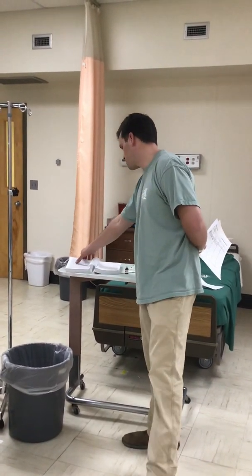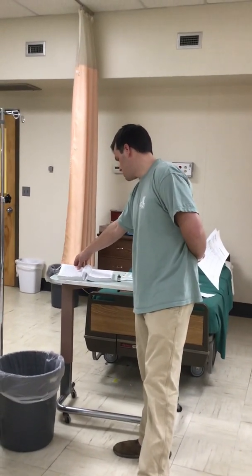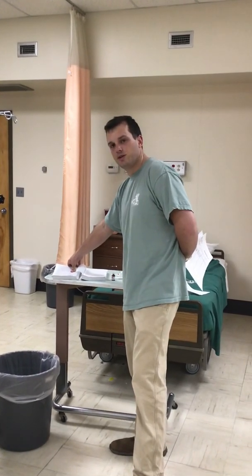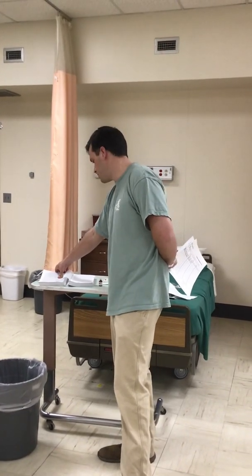Rate of administration. So 30 milligrams needs to be administered over at least 2 minutes, or 1 to 2 minutes. I'm going to administer it over 2 minutes.